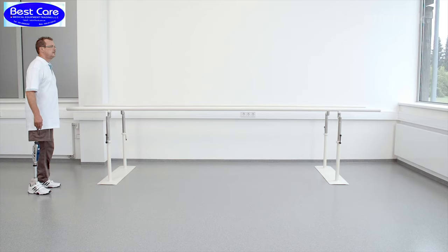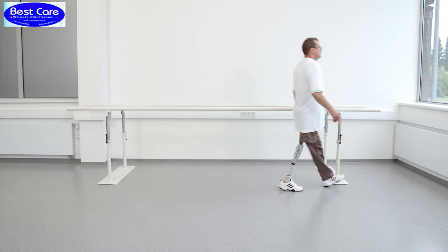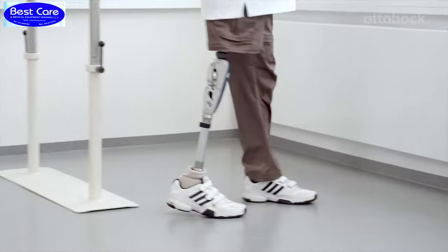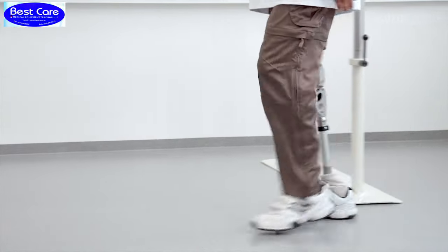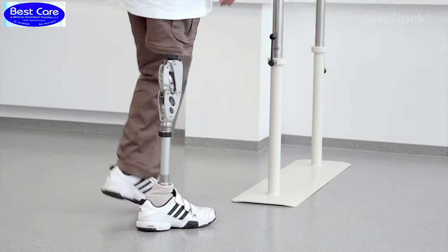To see if the swing phase is set optimally for the user, the user should walk at varying walking speeds. Equipped with a powerful hydraulic and a unique joint construction, the 3R60 controls all swing movements of the prosthesis even at higher walking speeds.